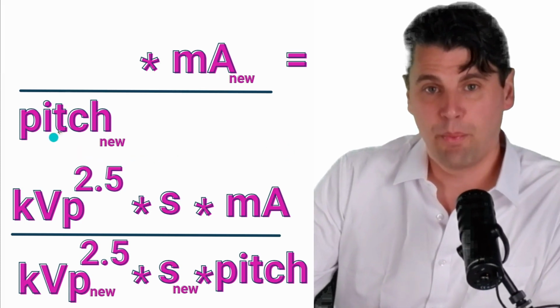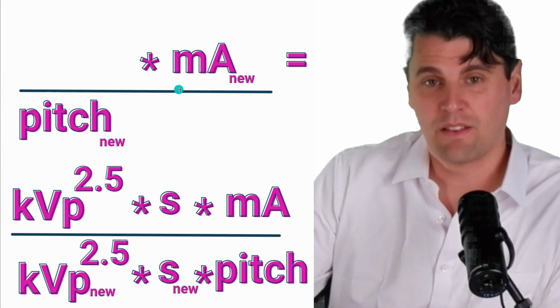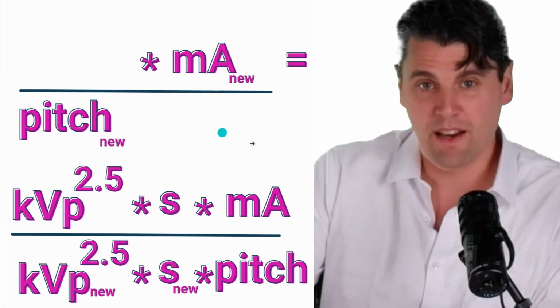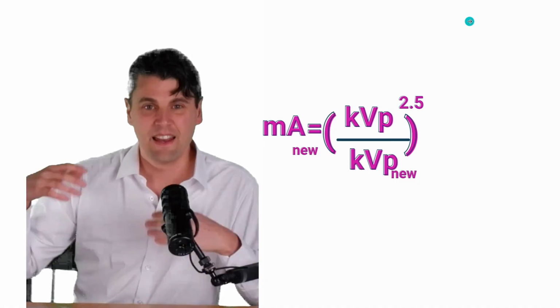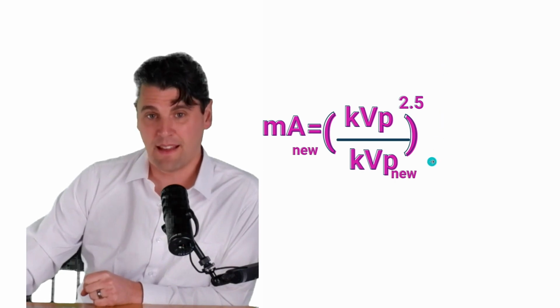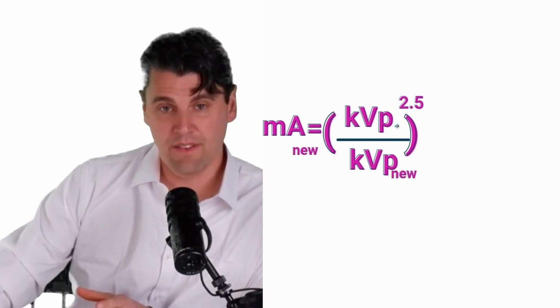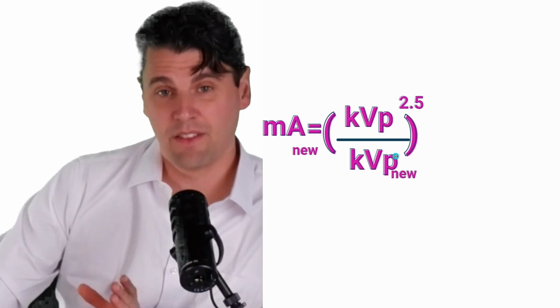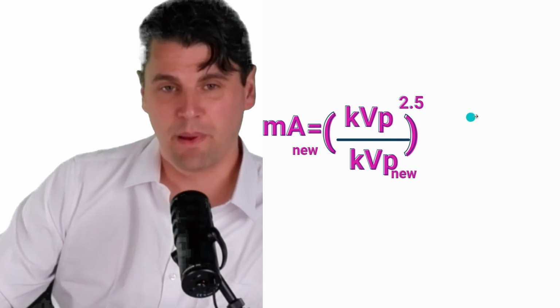Then let's get our pitch. This is in the denominator on the side with the MA, so it's going to move to the numerator on the other side. So let's move that over. Now we have a relationship for the new MA, and let's look at the terms that it depends on. The new MA goes as the ratio of the kVp divided by the new kVp to between 2.5 and 3.1, depending on the size.